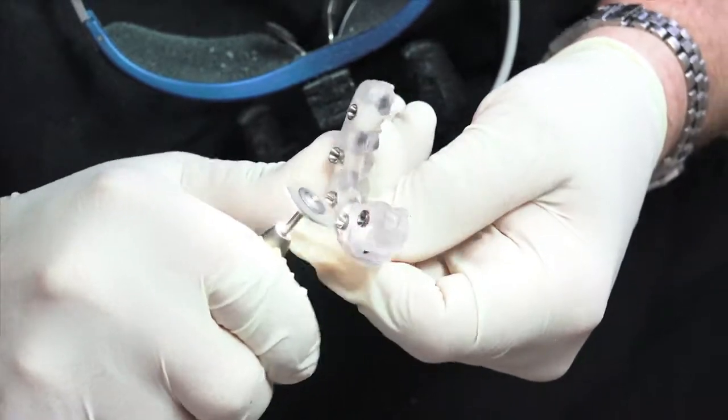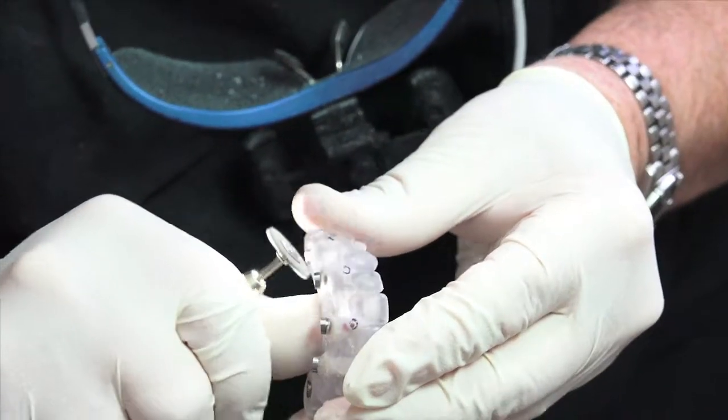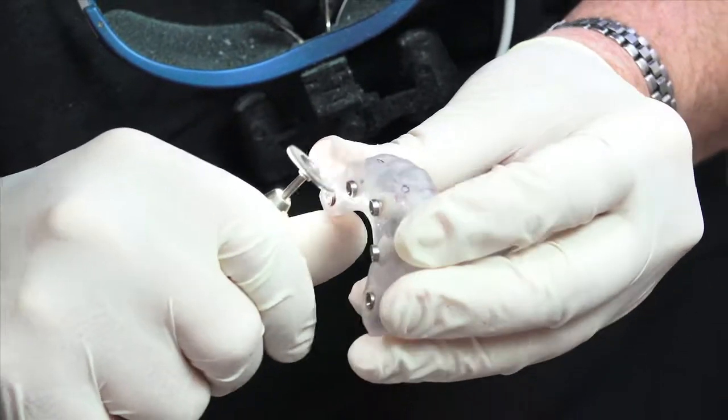The clear duplicate bridge along with the small fixation screws and the multi-unit analogs are typically sent to the restorative clinician for the first restorative appointment for the final prosthesis.